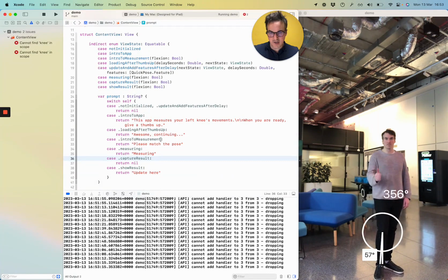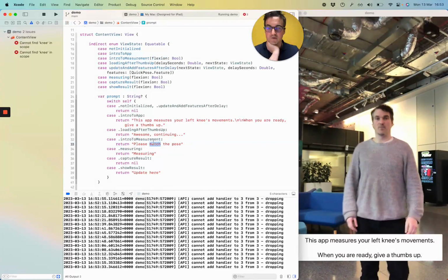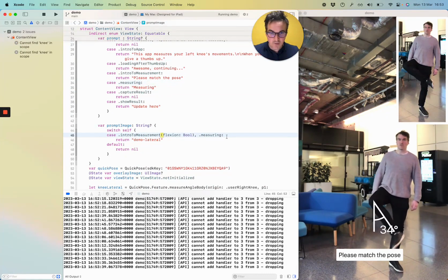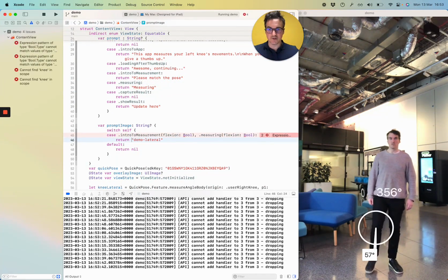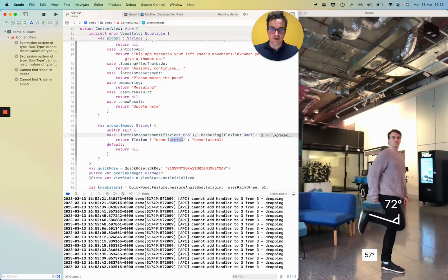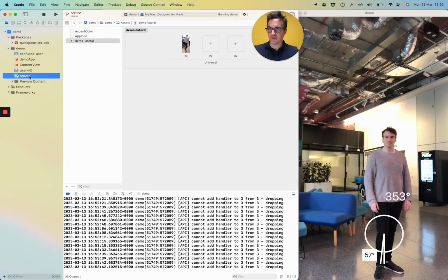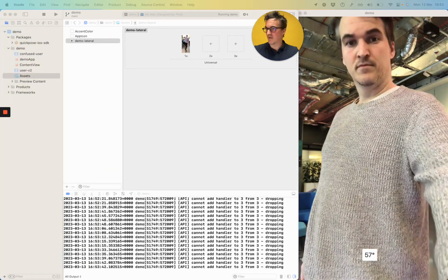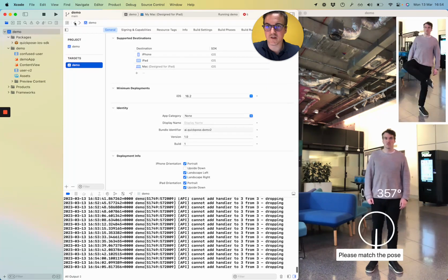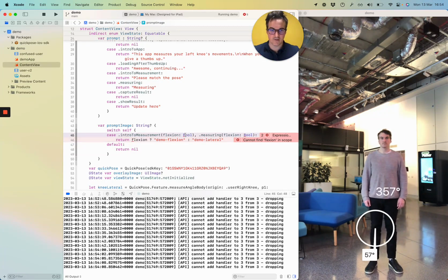The states here don't actually require knowing whether or not it's the flexion or not, so we can keep those without parameters. But these, it would be helpful. So if it's flexion, we want to return a flexion image, which I'll have to put in, and if not, a lateral image. So here's an image I prepared earlier. Like I was saying before, these aren't production ready, but they're good for building an interface and getting feedback from your team.